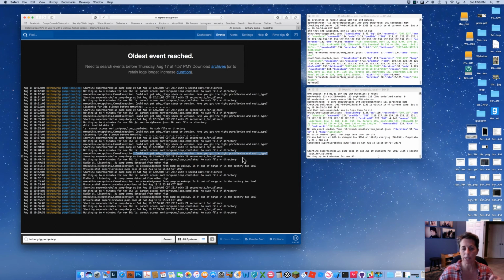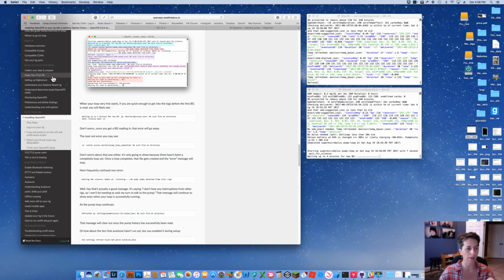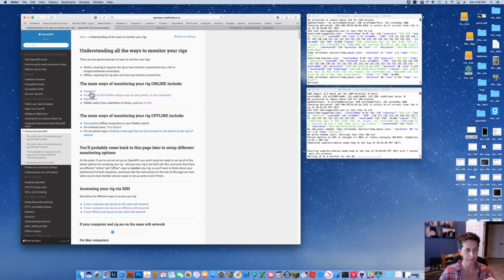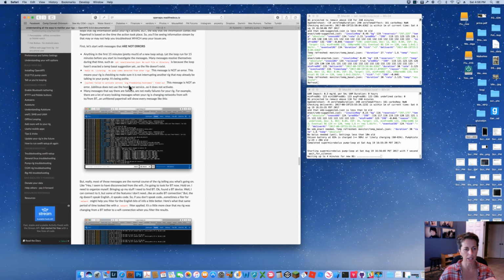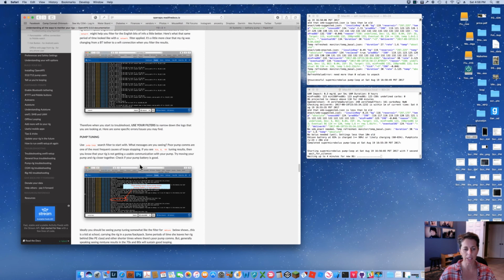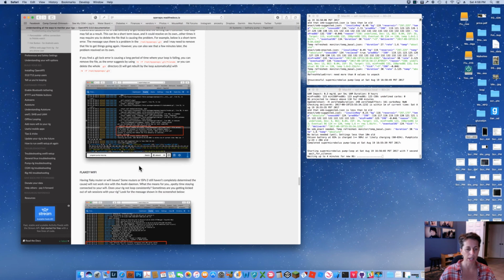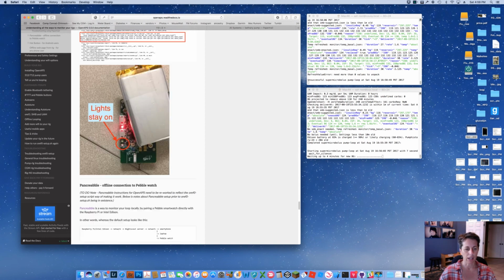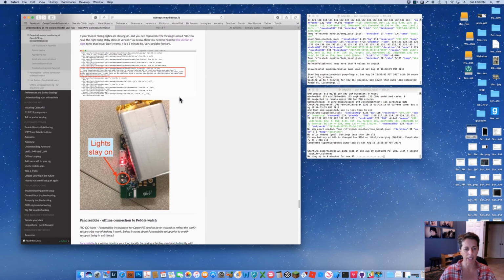This message, not as common, but typically this one happens when something on the Explorer board goes wrong. So I'm going to show you, we're going to go back here to the Papertrail link. At the bottom here, troubleshooting. Basically, if you come to this doc, it'll give you some ideas about the messages that you see and whether or not they're good messages, bad messages, what you should do about them. That subg message about have you got the right port or device right here.